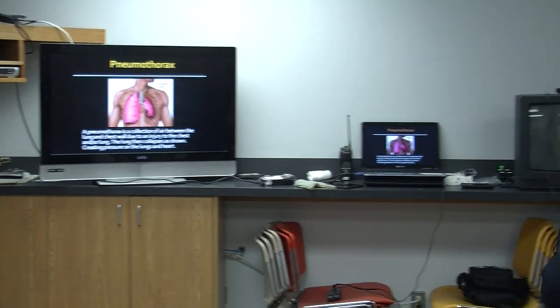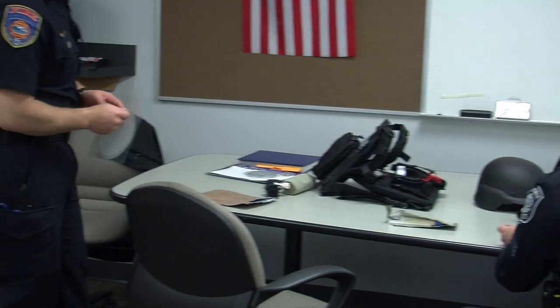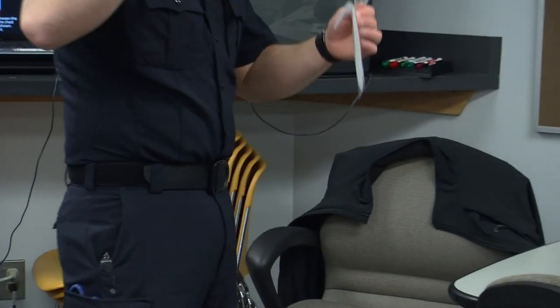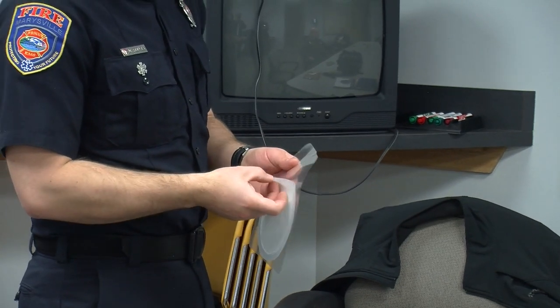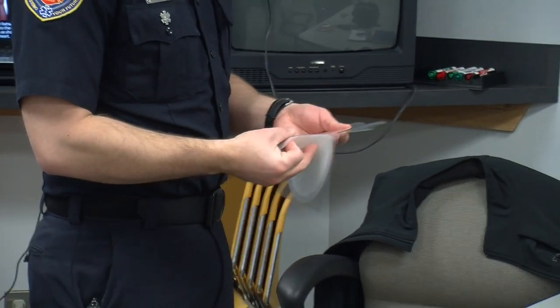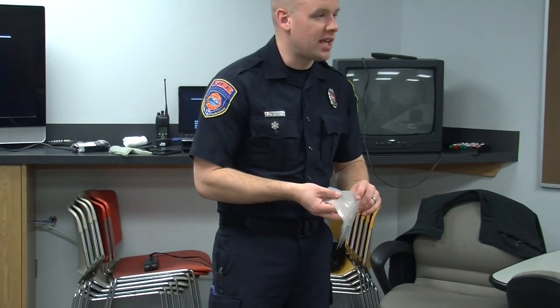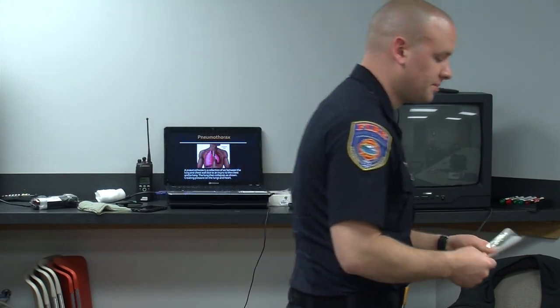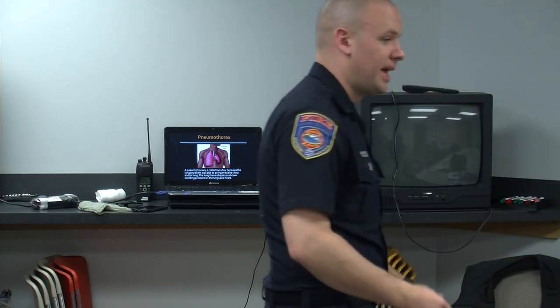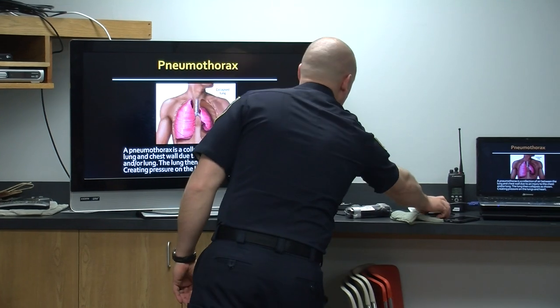But you guys can look at those, peel it back, feel how sticky it is. These things stick to sweaty, bloody, rainy victims, whatever. They'll stick and they'll re-stick a few times. They're designed off of the defib pads that we use for a cardiac monitor, the same type of thick adhesive, where if I have to peel it back, reposition it, whatever, stick it back down, it'll still work. Guys with the man sweater, it'll still stick to them, right?